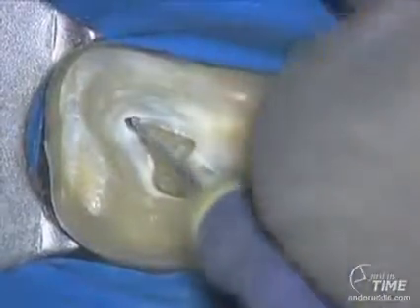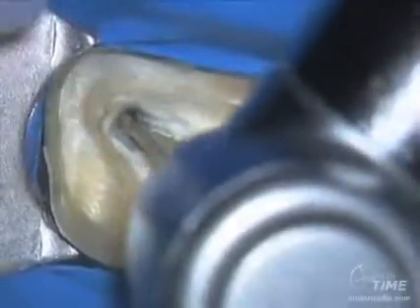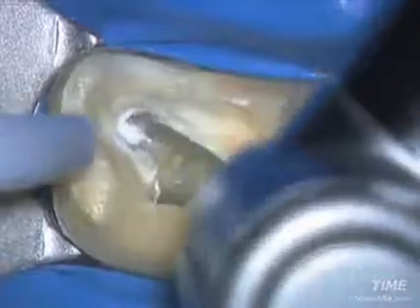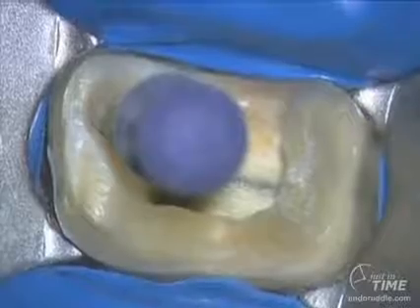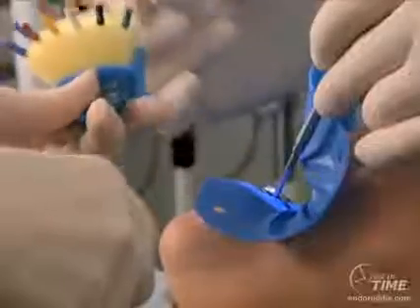Notice the file's off axis, so we can immediately hold the handpiece at that same angle. The angle of the file is the angle of the handpiece. Here you can see we're brushing out of the canal, a little bit of tapping in, a little bit of cutting in, and then more brushing and painting and marrying that axial wall to the pre-flared orifice. Notice how the instrument went to length almost immediately once the orifice is pre-flared.